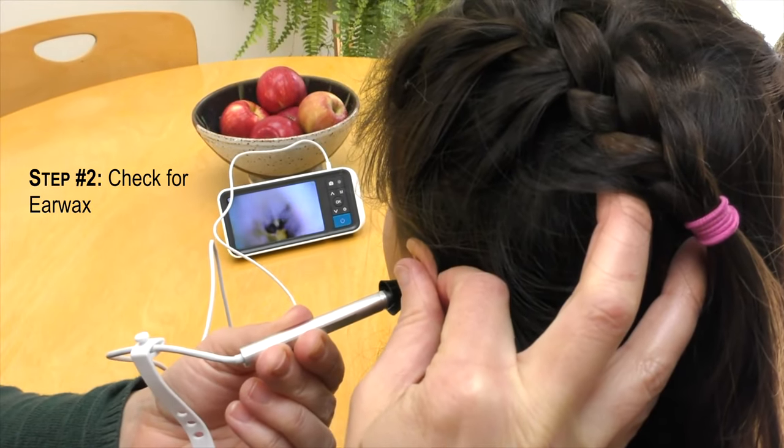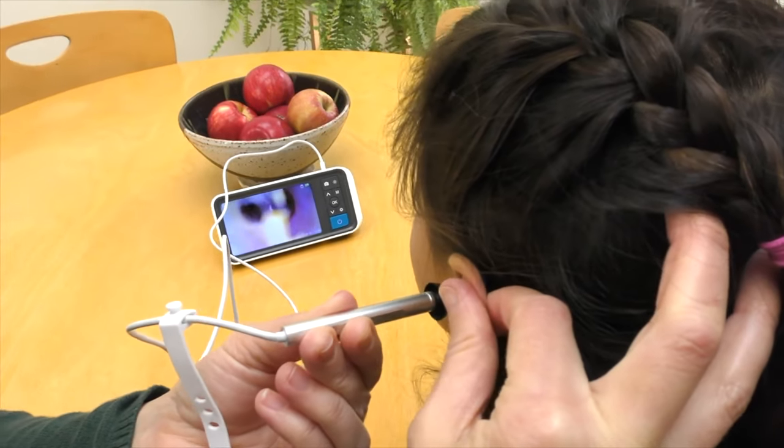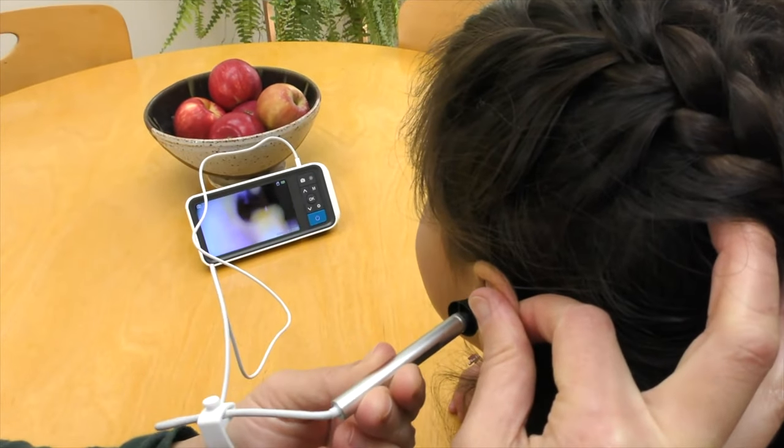Next, make sure there is no earwax in the ear canal. Sound can reflect off earwax and back towards the hearing aid's microphone.